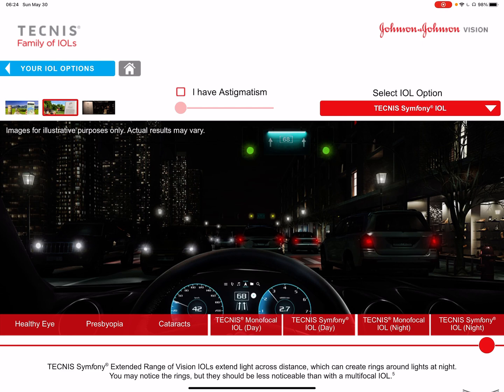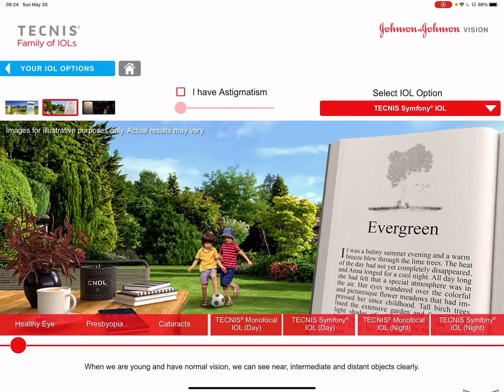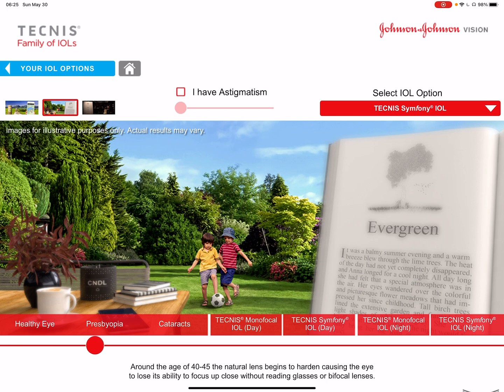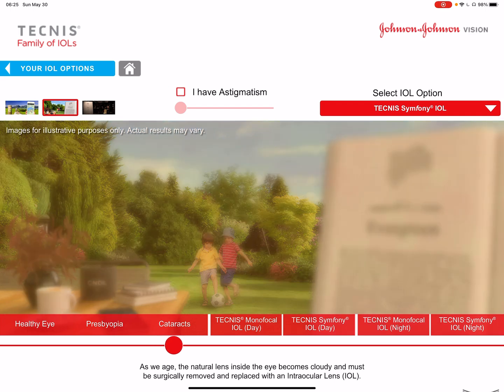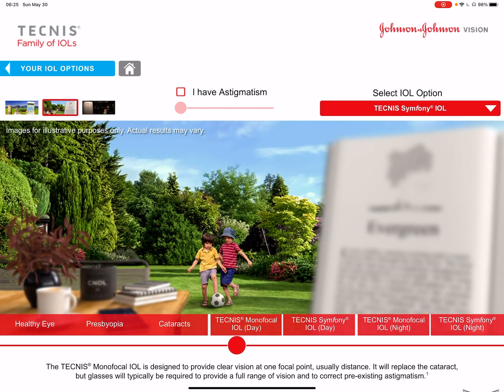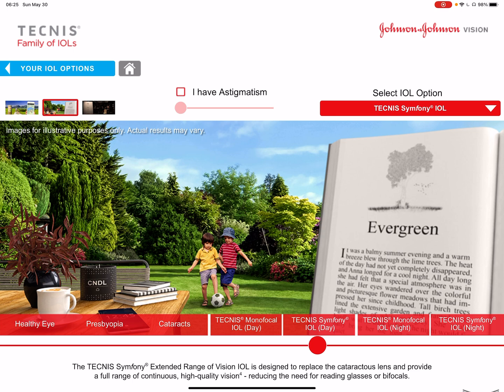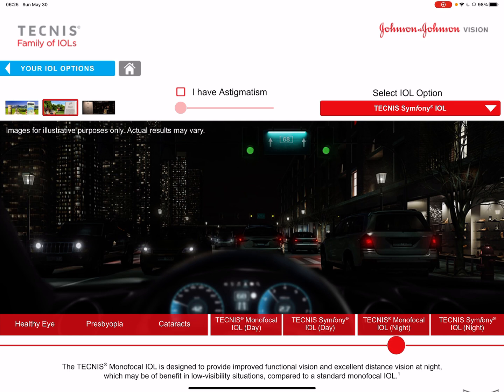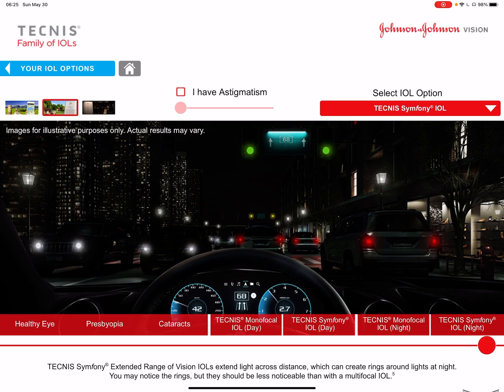Let's look at another view — an indoor scene. The book is in focus and everything is in focus when you're young. With presbyopia, the book starts to come out of focus first, then the intermediate, and then the cataract affects everything. With a monofocal lens you see the distance, but you don't see the close-up and intermediate. With synergy, symphony, or multifocal lenses you will see all of them in focus. The trade-off is halos and glare for the multifocal options.